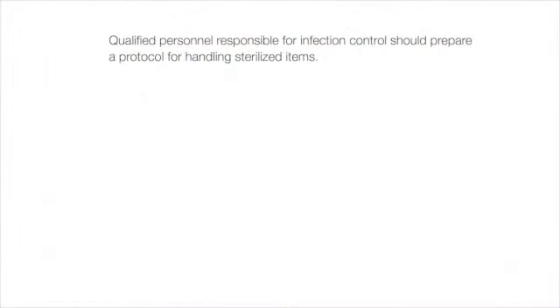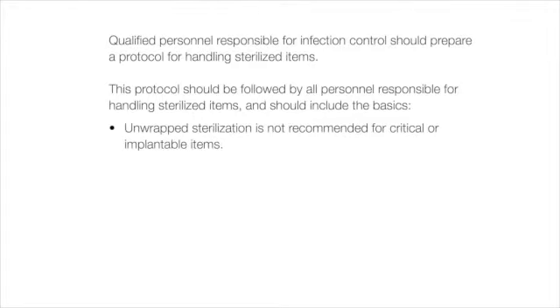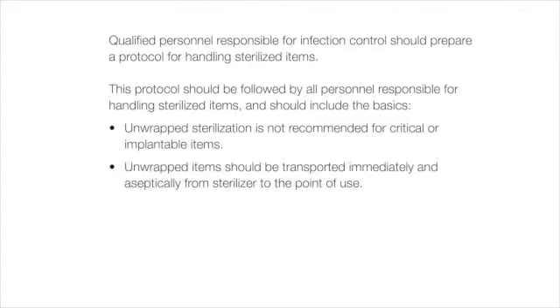Qualified personnel responsible for infection control should prepare a protocol for handling sterilized items. This protocol should be followed by all personnel responsible for handling sterilized items, and should include the basics. Unwrapped sterilization is not recommended for critical or implantable items. Unwrapped items should be transported immediately and aseptically from sterilizer to the point of use.